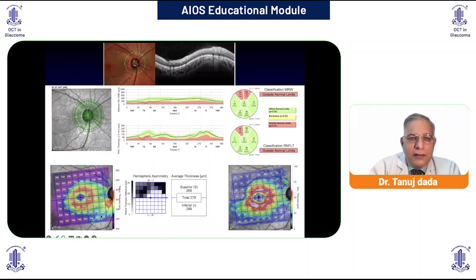See the total macular thickness, this blue zone here, going towards the disc. So definitely more blue superiorly than inferiorly. Hemisphere asymmetry showing definite loss of the superior macular thickness as compared to inferior. And then ganglion cell, you can compare inferior temporal ganglion cell with superior temporal.